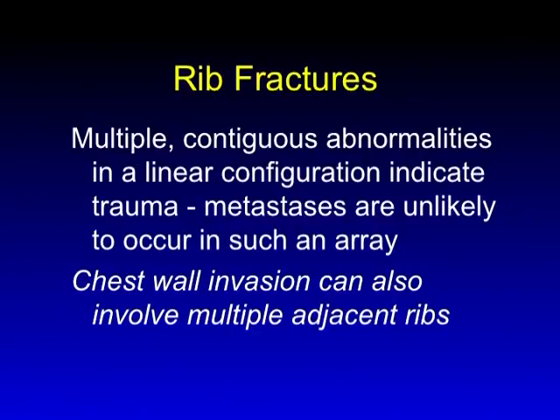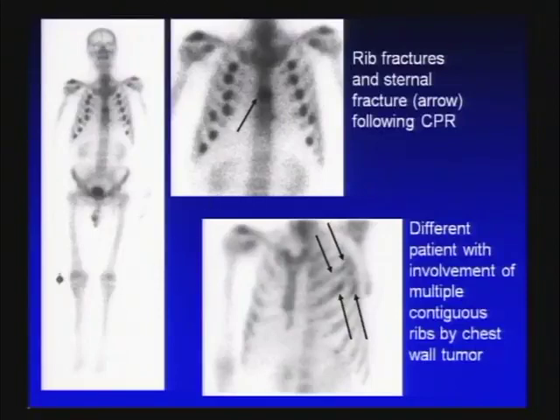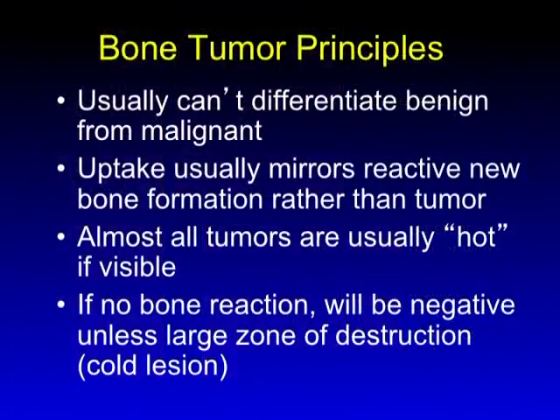Rib fractures are very commonly seen on bone scan, usually as incidental findings. A fracture on bone scan looks like a fracture on CT — a short segment transverse abnormality. They often involve multiple ribs and are fairly contiguous. If you see contiguous abnormalities in a row that look like fractures, they probably are fractures. Here we have multiple anterior rib fractures as well as a transverse sternal fracture — CPR-induced abnormalities. The commonest location is at the costochondral junction. On the lower right is a patient with contiguous rib involvement that looks entirely different — this is chest wall involvement by tumor, in this case chest wall sarcoma, but also seen in lung cancer with pleural invasion.